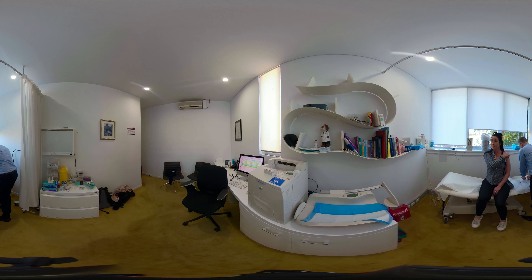And we'll just do this quickly, get it over with. I've got a little band-aid here, I'll pop on. There. That's always the hardest bit, is getting the band-aid out. Okay, and if you feel a little pressure, we'll move those hands. Pull that out. And that's all done.